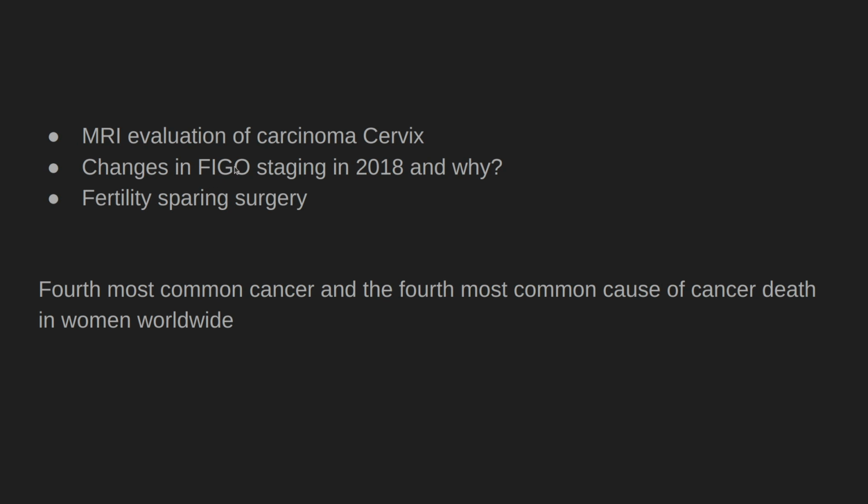So today's talk will discuss the role of MRI in evaluation of cancer of the cervix, and we'll also discuss the FIGO staging, which was updated in 2018, and all the updates that were incorporated in the recent edition and why they were important, and the role of fertility sparing surgery and all the surgical options there are.